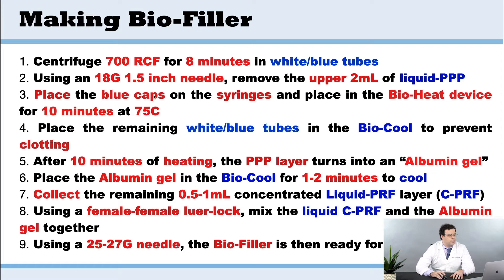Then we're going to place the blue caps on the syringes and place them in the bioheat device for 10 minutes at 75 degrees Celsius. The remaining tubes with lids on go into the bio cool device, which is designed to prevent clotting and basically double the working properties of liquid PRF.